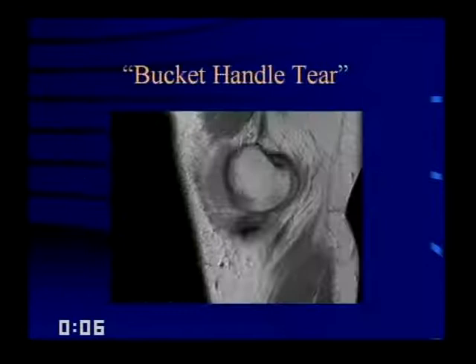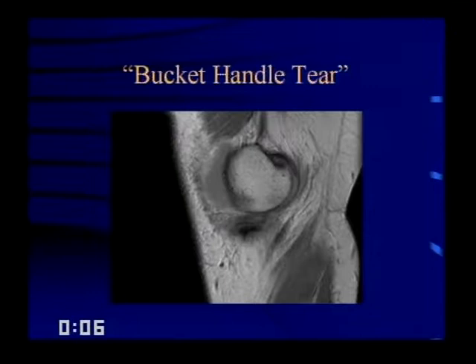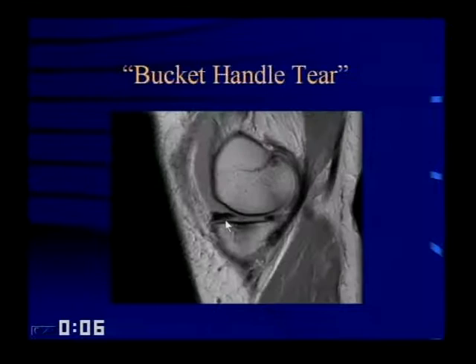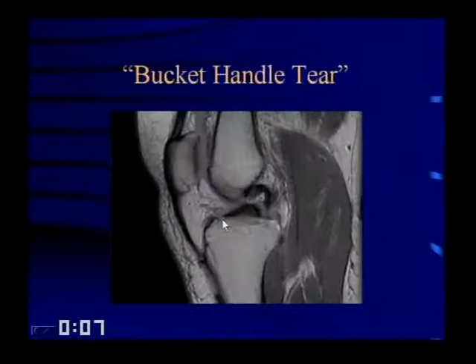Here's an example of a bucket handle tear. Starting from the outer sagittal slice and working toward the intercondylar notch, there's not much of a body. On the next slice, the anterior horn is much bigger than the posterior horn — recall the posterior horn should be larger. On subsequent slices, you start to see two little anterior horns, which of course there shouldn't be. Then you see the classic double PCL sign: the normal PCL here, and the flipped fragment in the intercondylar notch making a second PCL.